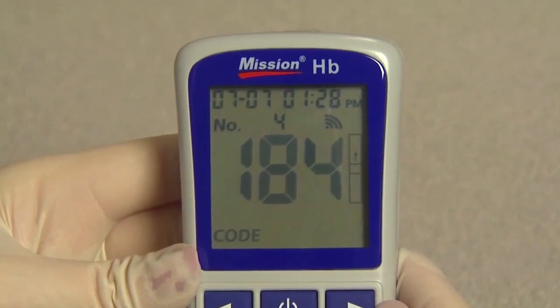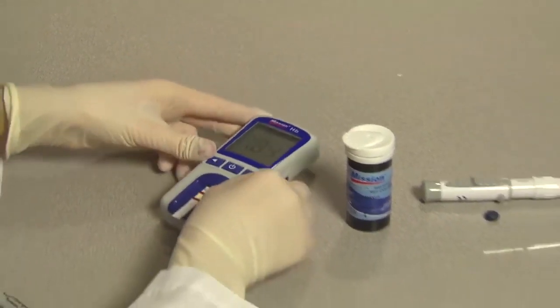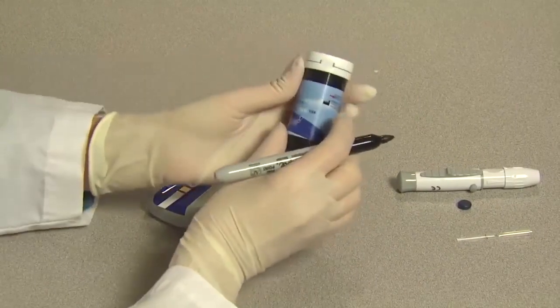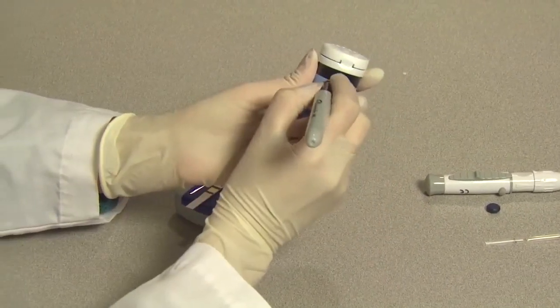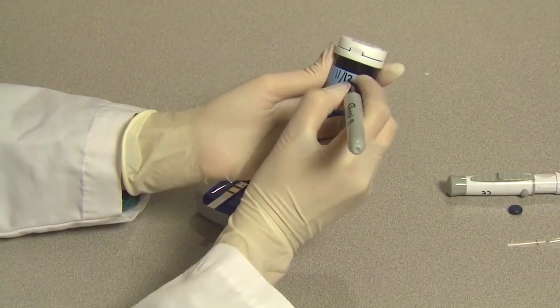The blood drop symbol will flash when the meter is ready for the specimen to be applied. Make sure you write down the date on the canister if opened for the first time. Discard the canister and test strips after 3 months from the date the canister was opened.